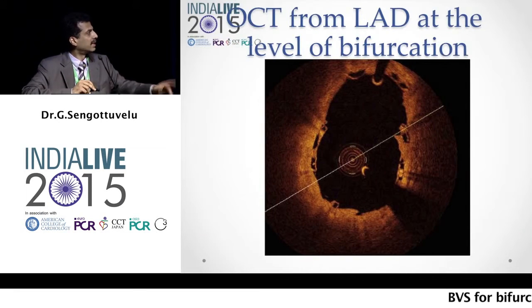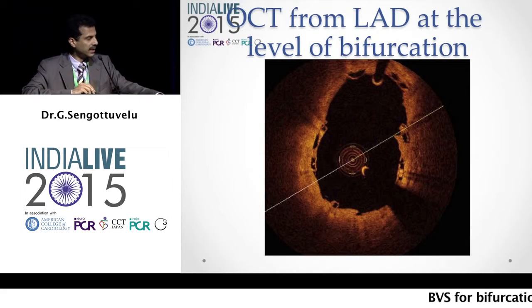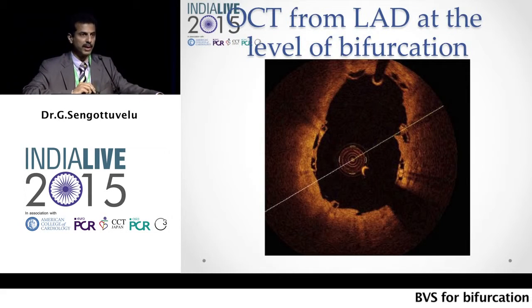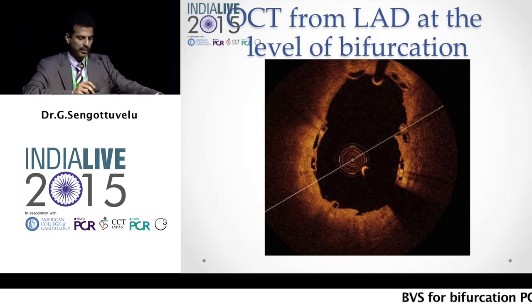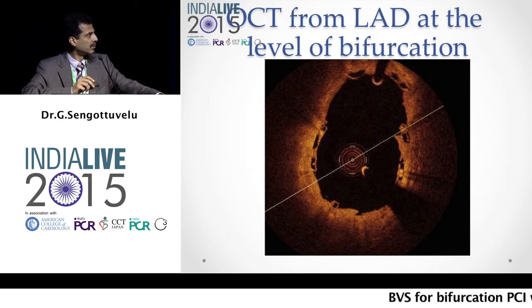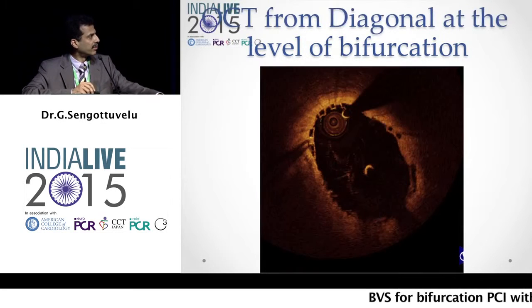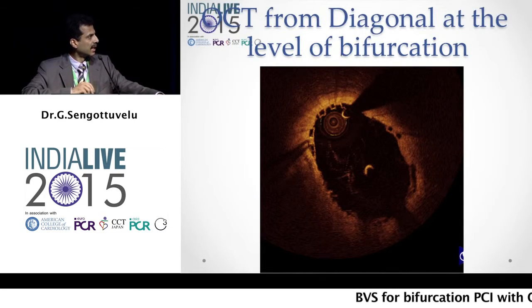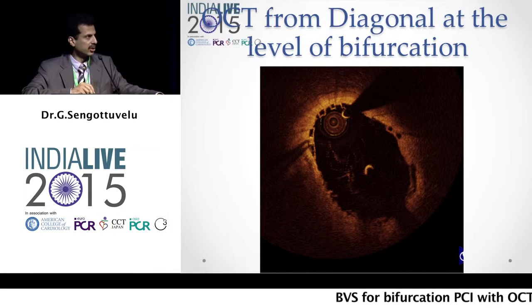This is the OCT from the LAD, where you could see the bifurcation is very well open, and you could see part of the scaffold in the diagonal at the 12 o'clock position. And there is an OCT from the diagonal, where you could see the scaffold very well deployed at the bifurcation at both the diagonal and the LAD.